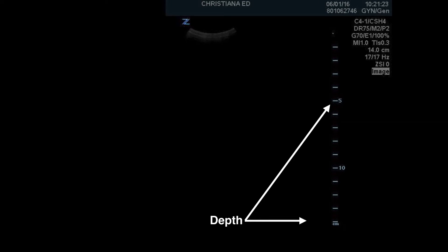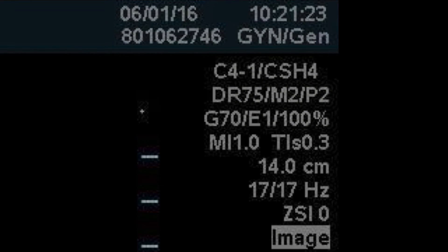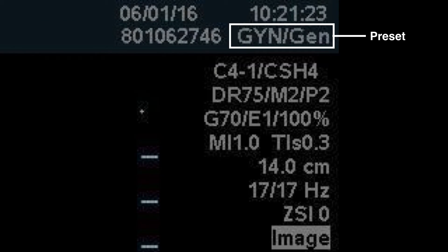You can see the depth marker on the side with centimeter marks and individual tick marks for each centimeter. You will see important information in the upper right-hand corner, including the date and time and the preset that you're in.